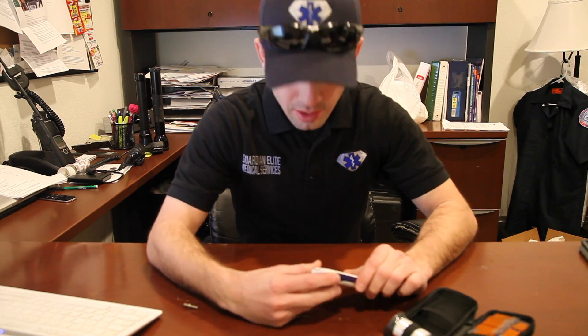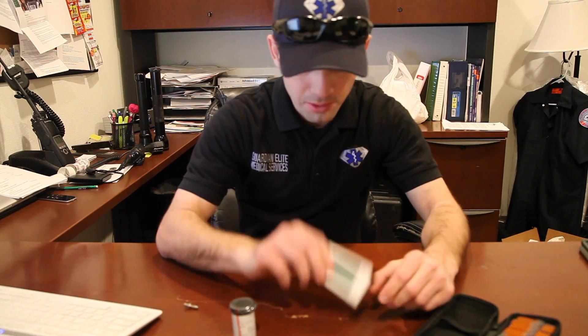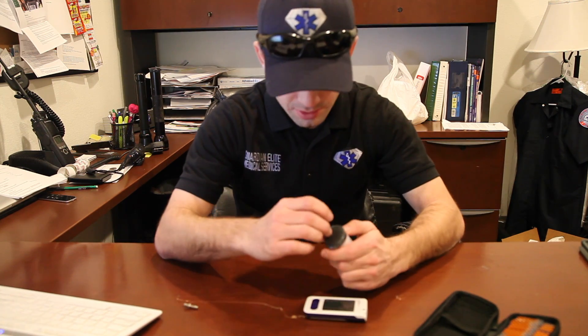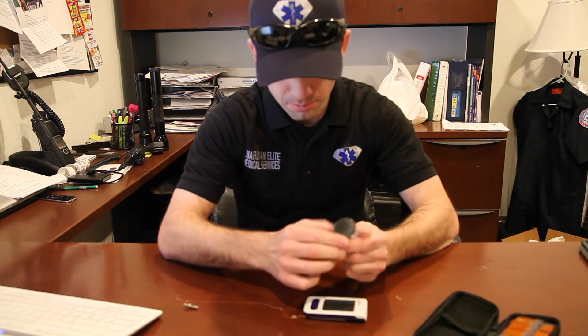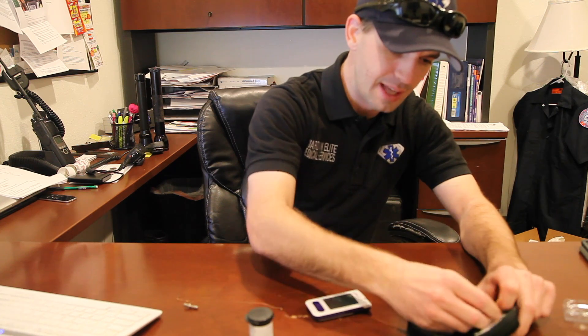Hey Guardian employees, in this video we're going to discuss our blood glucometers, the Quintet AC glucometer. In order to do a blood sugar, you need a few things: you need your glucometer, you need some test strips, you need an alcohol prep pad, and you need a lancet.